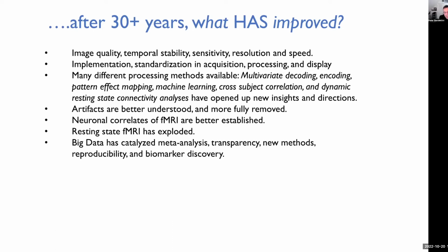Big data is a major improvement in the sense that we have these large pooled data sets that have catalyzed meta-analysis, more transparency, even new method pooling and reproducibility in biomarker discovery. Even though we haven't actually discovered biomarkers yet, it's catalyzing it, hopefully. Individual assessment in fMRI is growing. I'll talk a little bit more about this later. I think that's a big thing, which we're just getting our heads around.